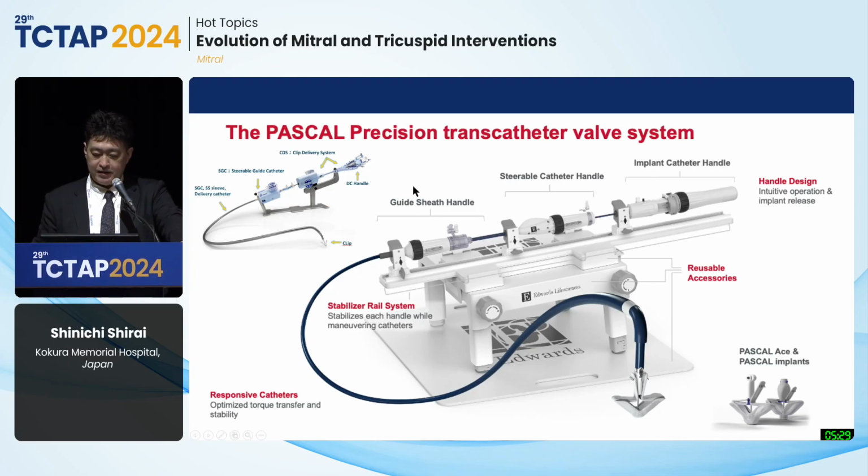The handles are just like other companies': the steerable catheter handle is like this, and the implant catheter handle. Steering down the mitral clip and some manipulation of the clip's arm. Then, in order to grasp the clasp, with the implant catheter.